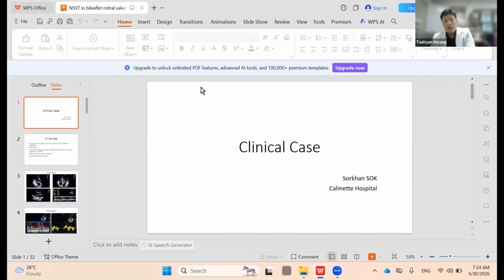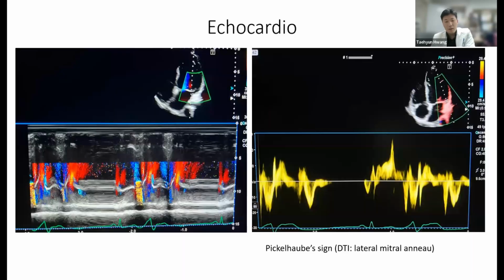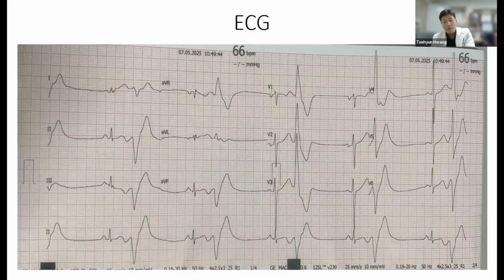And also, as Dr. Key mentioned, if ICE was available, it is very useful to see the stability of the catheter and the visualization of the papillary muscle. Do you usually use ICE, not for this case but for other VT cases? And lastly, after the ablation, do you perform any inducibility tests like infusion of isoproterenol, and also Holter results after the procedure?